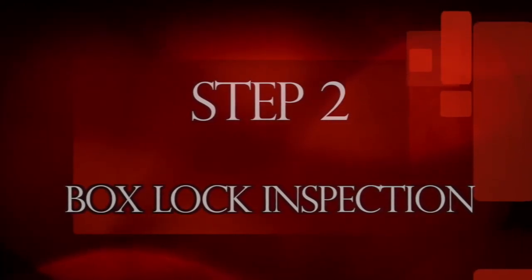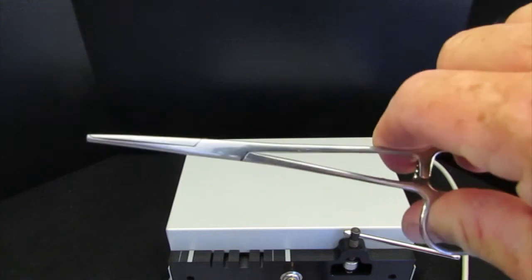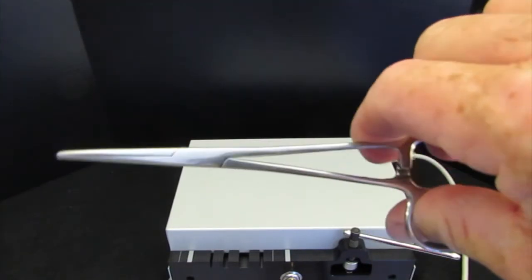Step two: box lock inspection. When properly adjusted, the box lock allows the instrument to open and close smoothly while firmly holding the jaws as they close.